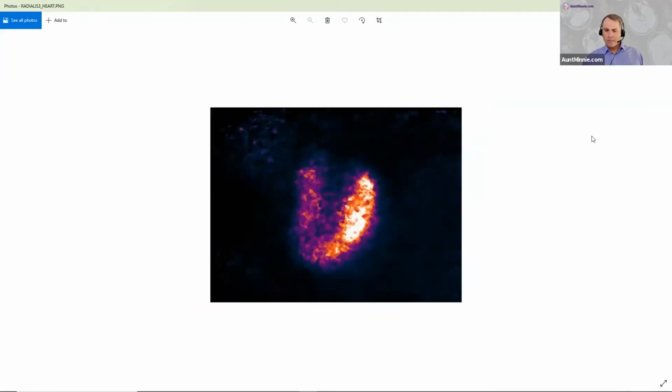Mm-hmm. And so we now have a cardiac image here too. Obviously PET and cardiac imaging is very interesting right now, and there's a lot of focus around this area. And we do feel that there are these really exciting places where a lot of innovation is happening that could really be helped by having sensors that are really tailored to getting very close to the target.